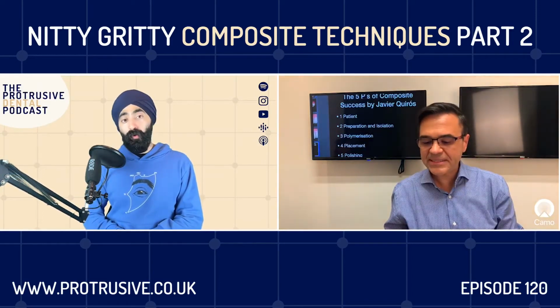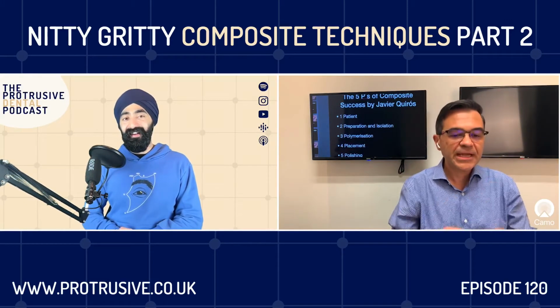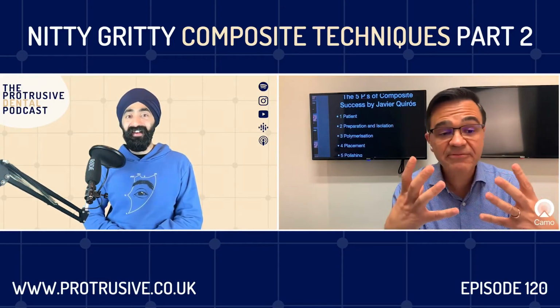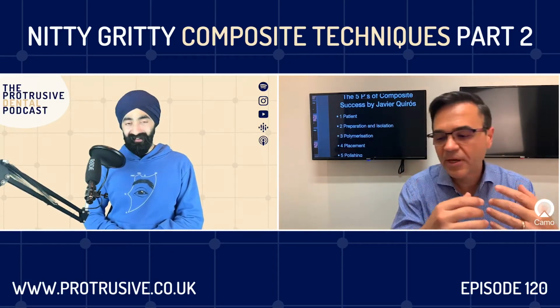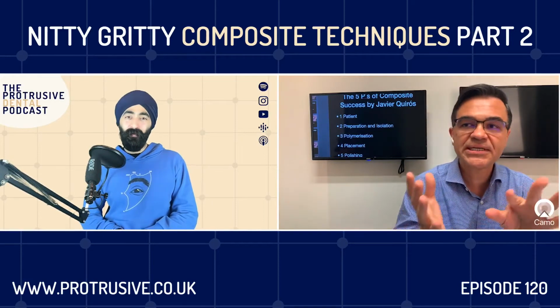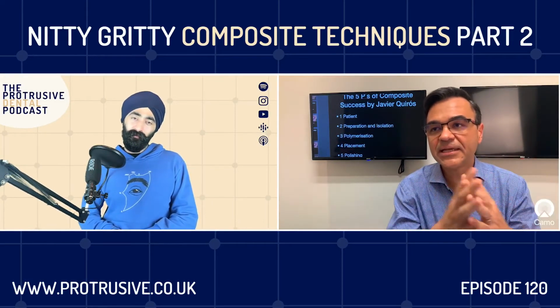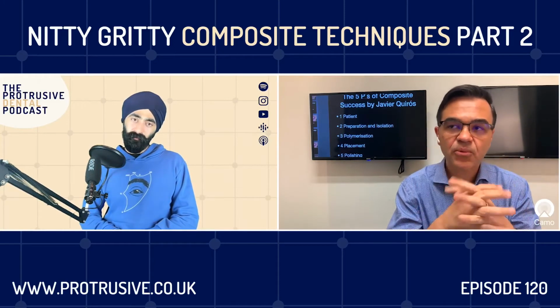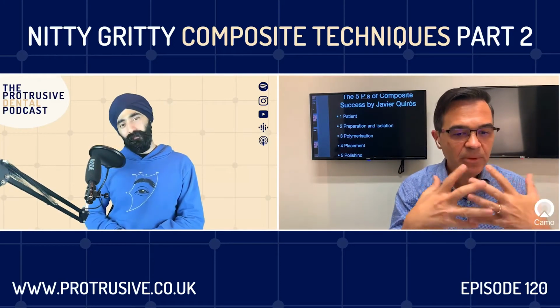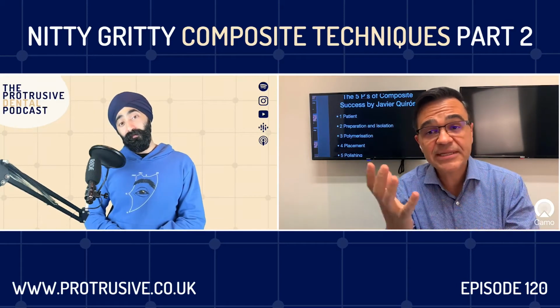Amazing. So those are the 5 Ps of composite success. Like I told you, I always do the smile design first, then the wax up, then I transfer the wax up with the matrices to my patient's mouth, and then I layer freehand the buccal part with microfill composite, and then we polish. I use that technique every single day, Jazz.